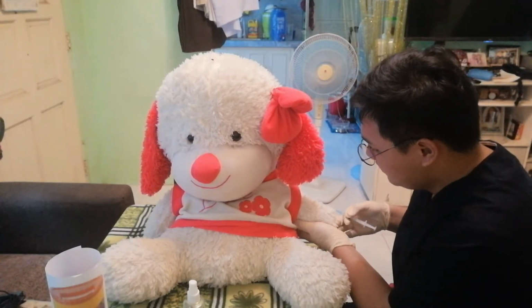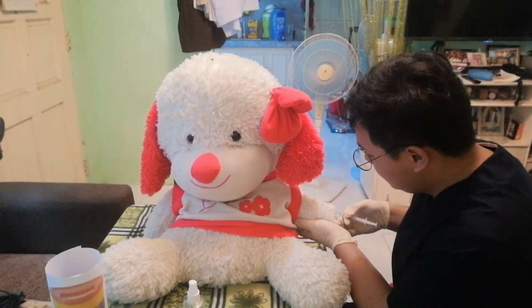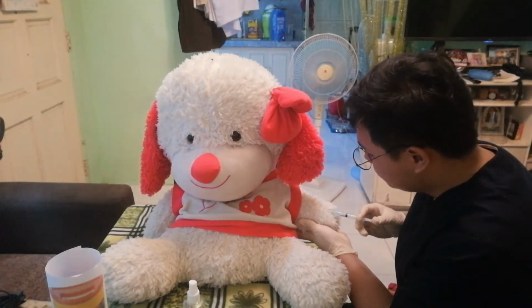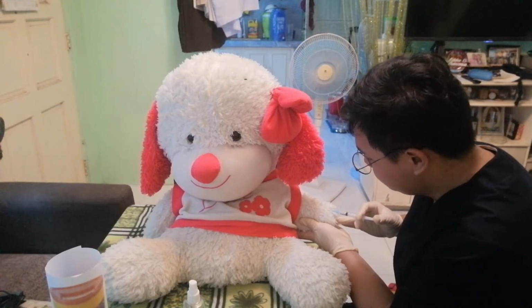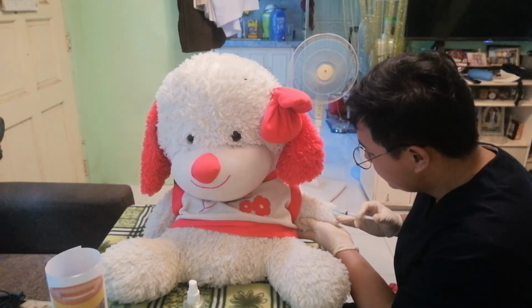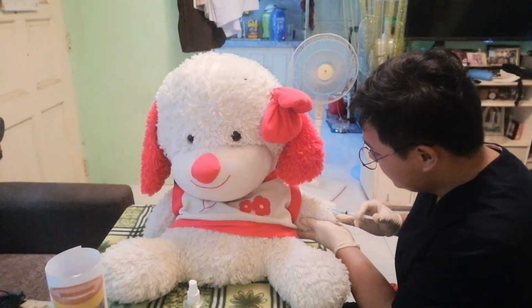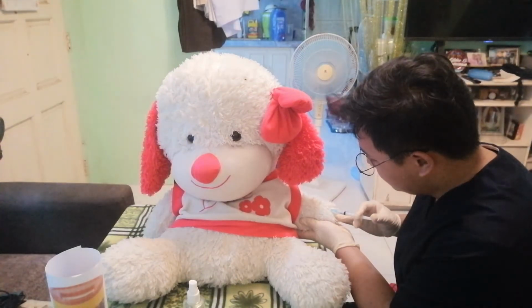Now we will be inserting our needle for about 1/8 inch. After that, we need to administer our medication slowly. We need first to stabilize the needle as well as the syringe, and we need to inject our medication smoothly, carefully and slowly. Okay, ready po, in 3, 2, 1.